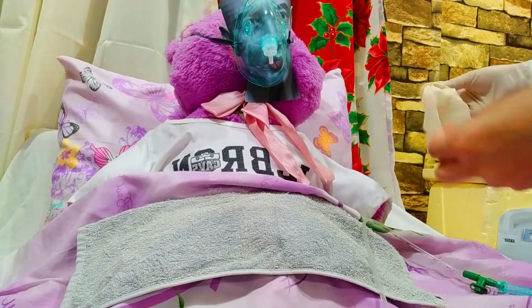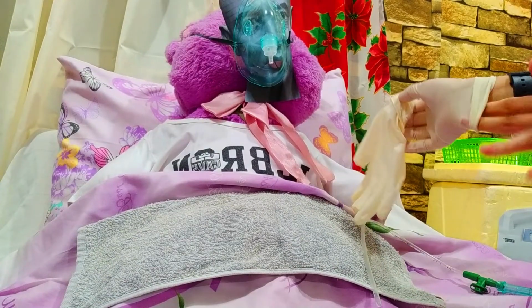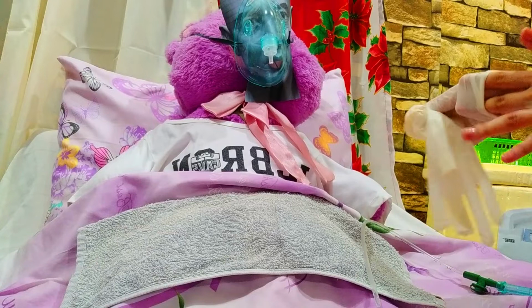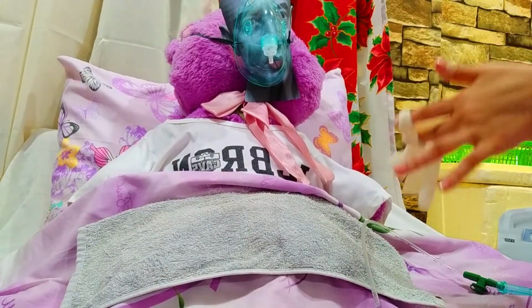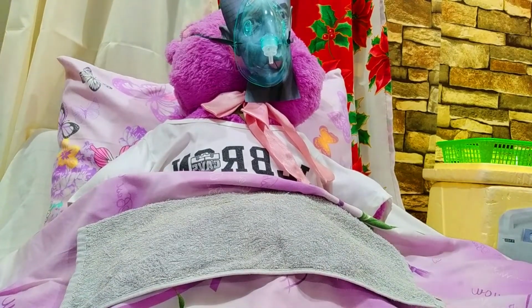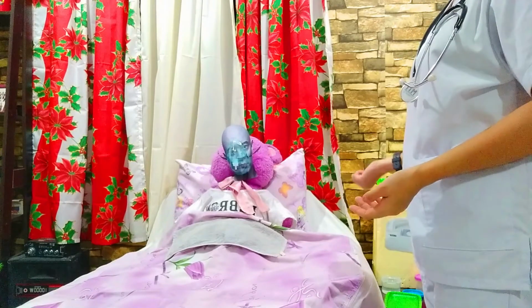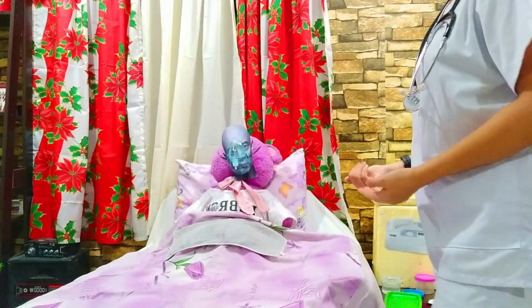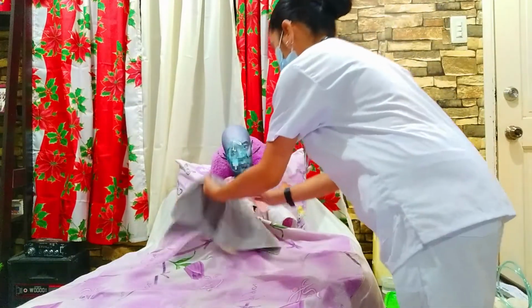And then remove the glove from the non-dominant hand and dispose of gloves, catheter, and the container with solution in the appropriate receptacle. And then we need to assist the patient to a comfortable position, raise the bed rail, and place the bed in the lowest position.